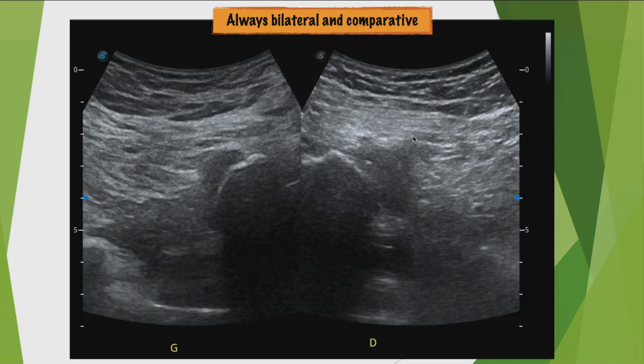Most importantly, the appearance of this conjoined tendon is extremely different. A tendon that appears enlarged, hypoechogenic, irregular, with here a large hypoechogenic patch that appears to be protruding from the tendon. We have a small anechogenic image in depth as well, which could very well be a deep hematoma located beneath the tendon. So you see, the bilateral comparison will open our eyes and enable us to see much better the things that need to wake us up.